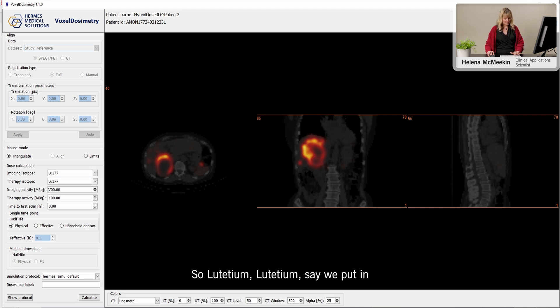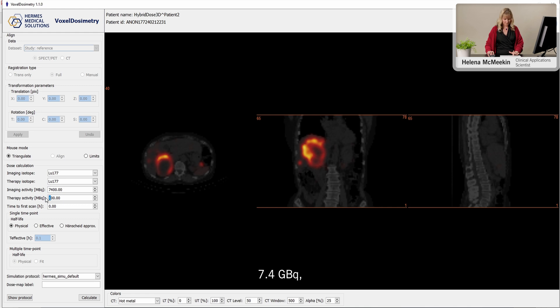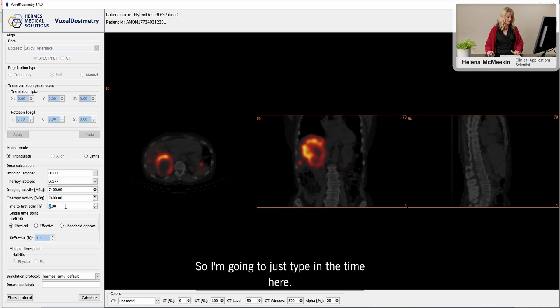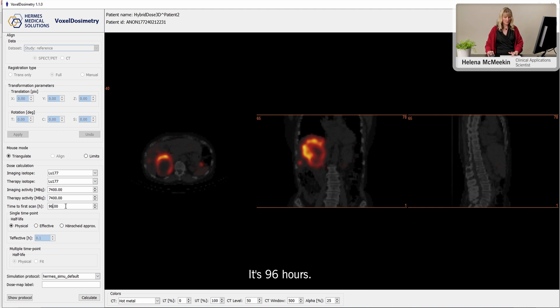For us this is post-therapy so lutetium-lutetium. Let's say we put in 7.4 gigabecquerels of lutetium DOTATATE and this is a day four scan, so I'm going to type in the time here — it's 96 hours.